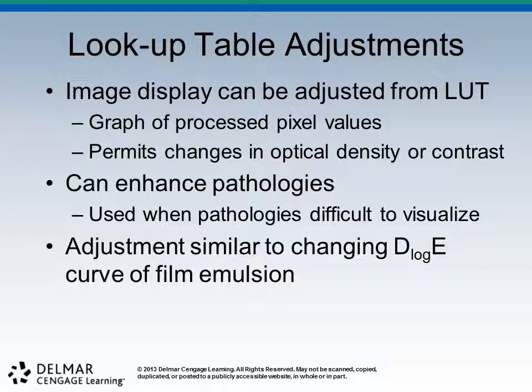And there are people out there writing programs, you've got an app for everything, to do the first or initial screening view on, say, mammograms and other things without a pair of human eyes. Now, they do overread them to verify, and we haven't got to the point where it's actually marketable. But if you could screen a bunch of mammography with a robot and then ship the suspicious ones off to a live doc, then she could overlook that, and you could make a whole lot more money. And of course, that's what it's all about. It's the science fiction guy coming out in me. Sorry.